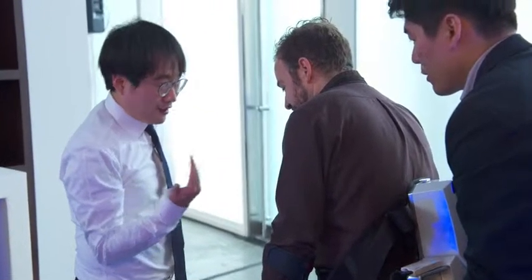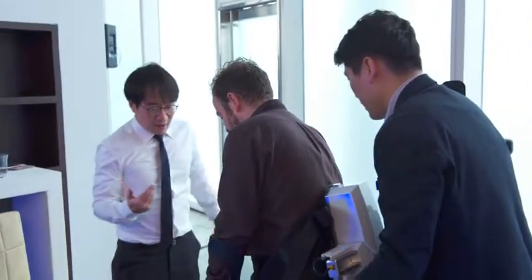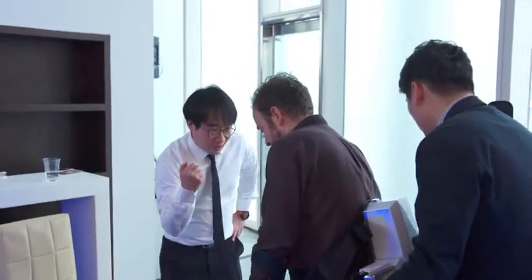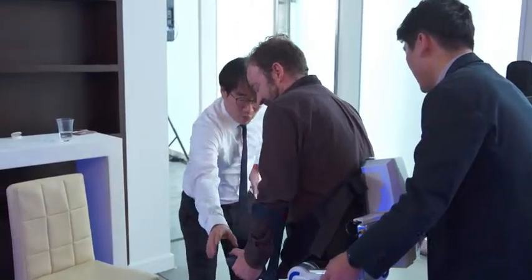Lean forward and to the left. One, two, three. Press button A — click, don't push, just click.